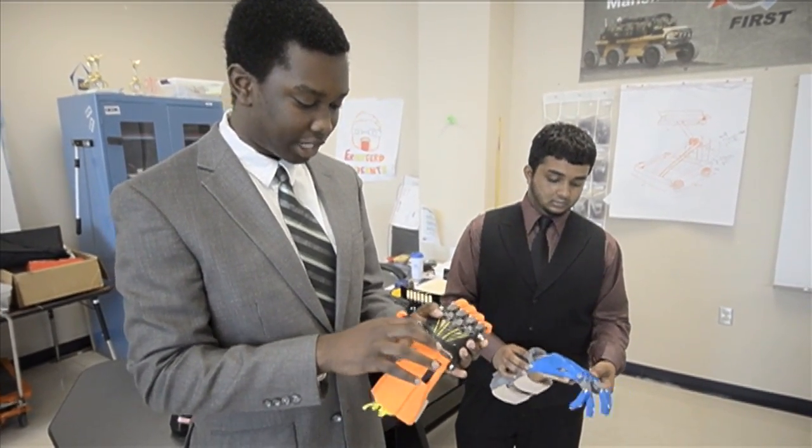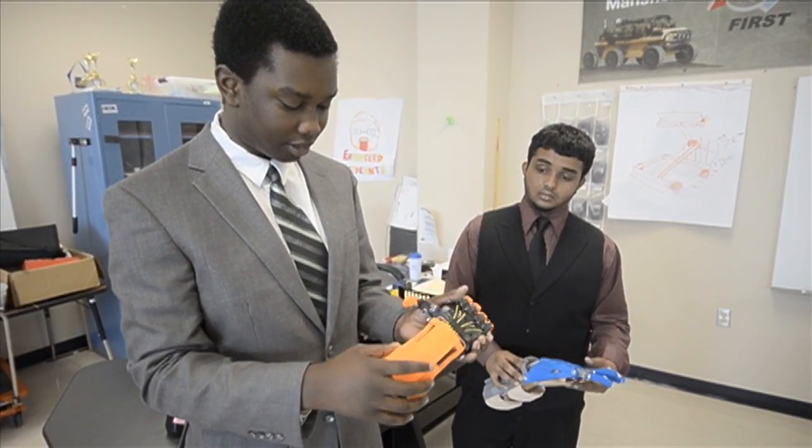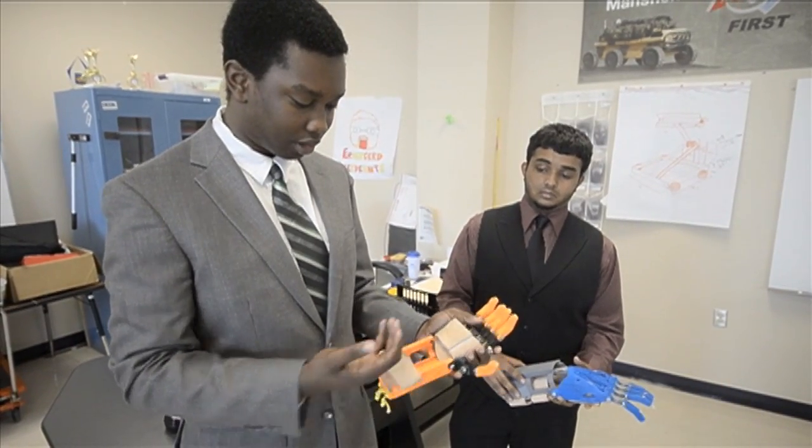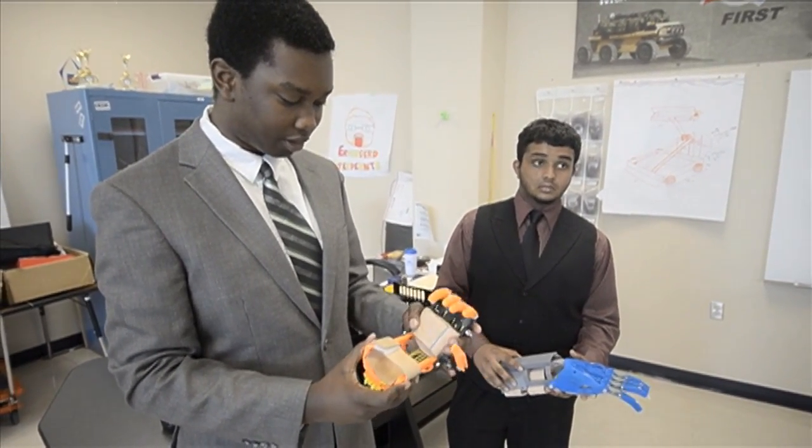Then we have to put tethers in to connect the fingers to the hand and to the gauntlet. And then we put the leather on so that way you can put cuffs in so the person can put their hand in it.